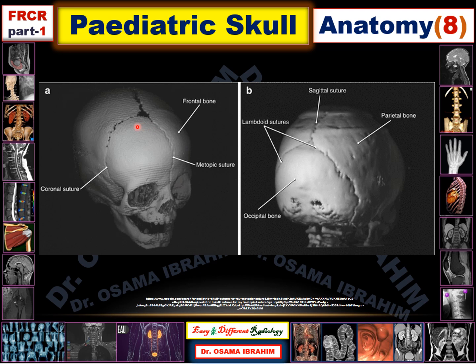The pediatric skull is characterized by sutures which are developing and unfused until certain periods of life. The suture in the midline separating the parietal bones on both sides is called the sagittal suture. In the anterior view, the frontal bone can be separated by an accessory suture called the metopic suture. The frontal bone is separated from the parietal bone by the coronal suture on both sides. From the posterior, the occipital bone is separated from the parietal bone by the lambdoid suture.